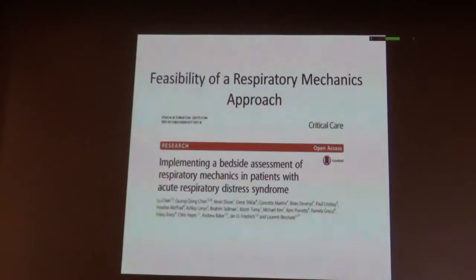We reported this very preliminary data about our experience of implementing a bedside assessment of respiratory mechanics, including esophageal pressure, in patients with ARDS. So in our ICU, for 3 years now, every patient with ARDS has an esophageal balloon, and we do these systematic measurements of respiratory mechanics, including the basic resistance, elastance, measurement of transpulmonary pressure, plus a number of very simple tests which help clinicians to better titrate the ventilator, hopefully.